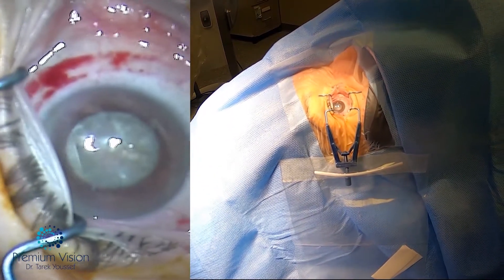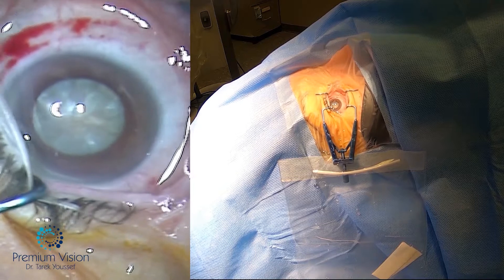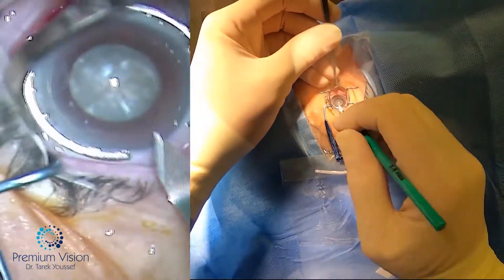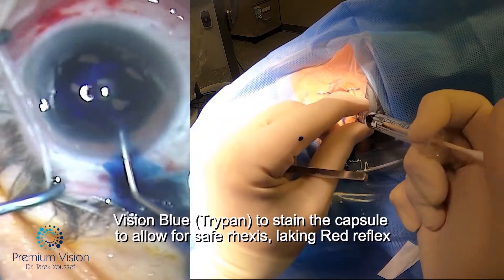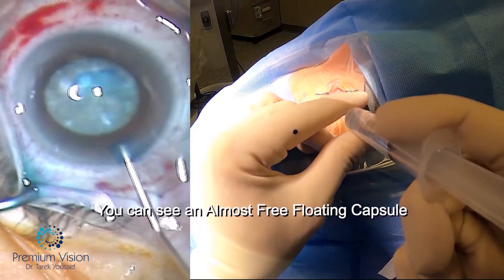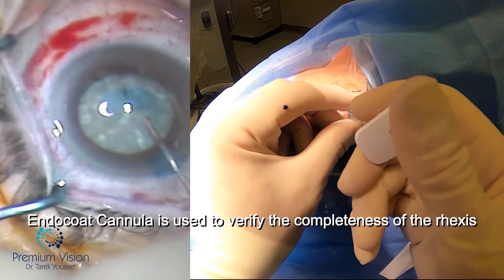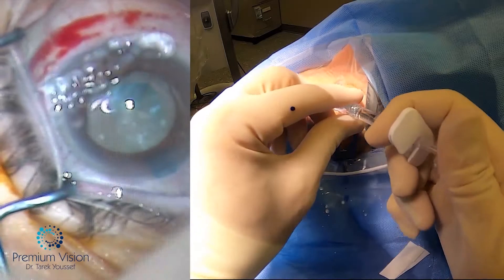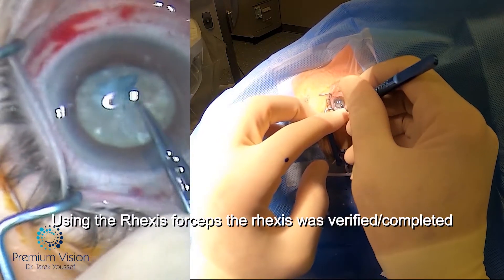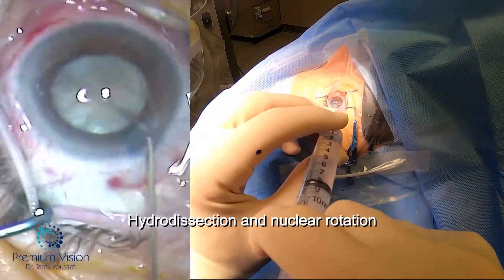Now to the surgery itself — you can see the hypermature intumescent cataract. You don't appreciate how intumescent it is, but the anterior chamber is very shallow because of the swollen cataract. With this, we worry about the Argentinian flag sign, which is the explosion when we do the capsulorhexis without the capsule access already being done. The capsulorhexis was done with the laser — here you can see the flap — but it needed to be completed with the rhexis forceps. You notice with the endocoat cannula that it's not complete at the bottom. So this is the most difficult step in this kind of surgery: to do the capsulorhexis.